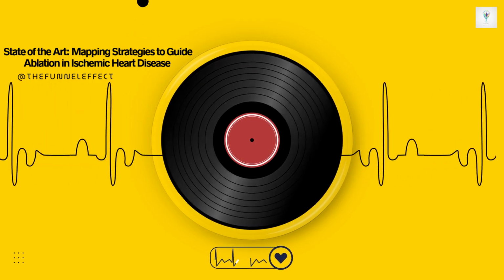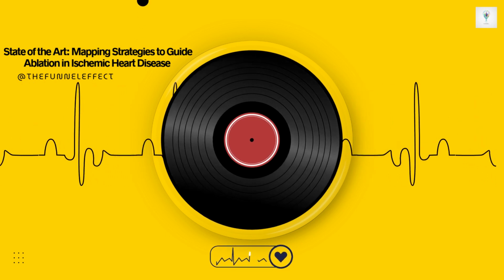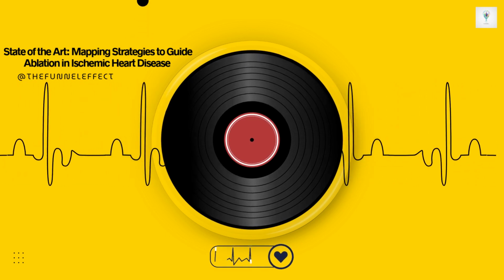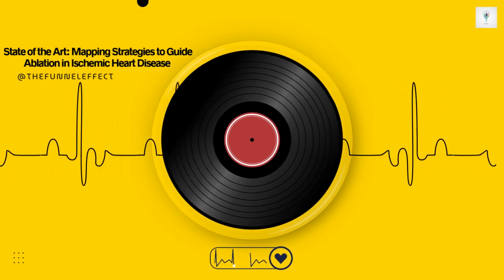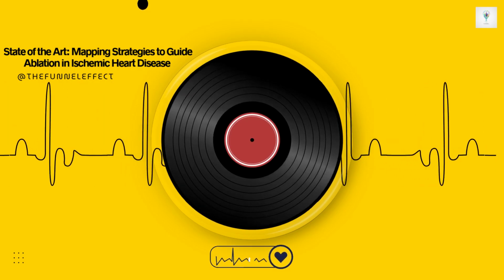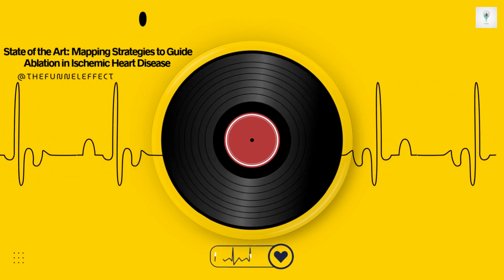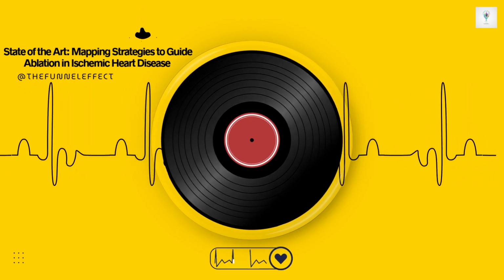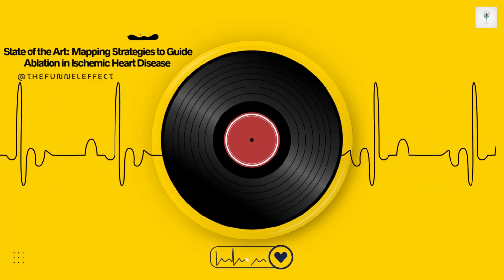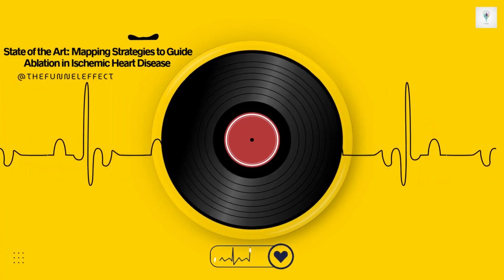That sounds incredibly precise. Does that SQRS interval also give you information about where you are along the isthmus channel? It absolutely does. It's like a GPS within the isthmus. Remember, the SQRS interval is the time it takes for your paced beat to travel from your catheter tip through the remainder of the isthmus and finally exit to start depolarizing the wider ventricle. So a short SQRS interval, the review suggests maybe less than 30% of the VTCL, means you're pacing very close to the exit of the isthmus. The travel time to get out is minimal.